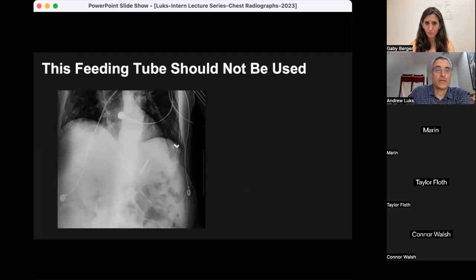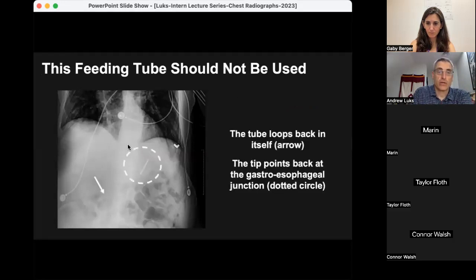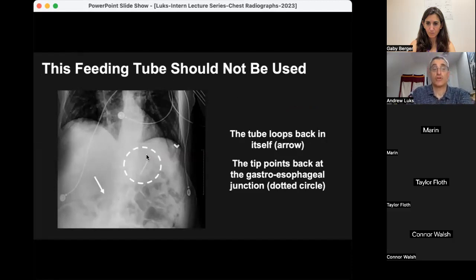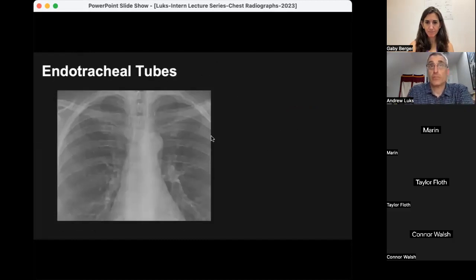Here's an example of a feeding tube you would not want to use: the tube comes all the way down the midline but it loops back in the stomach and the tip is pointing back up towards the gastroesophageal junction. This would be one in which you would ask the nurse to try to replace the catheter.